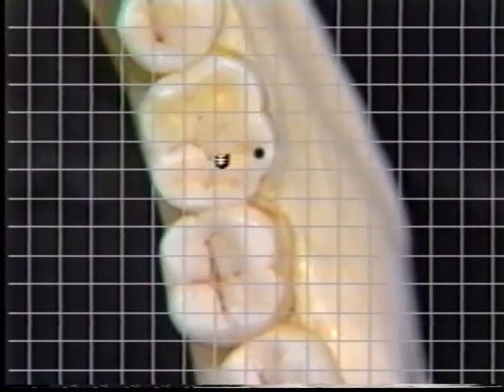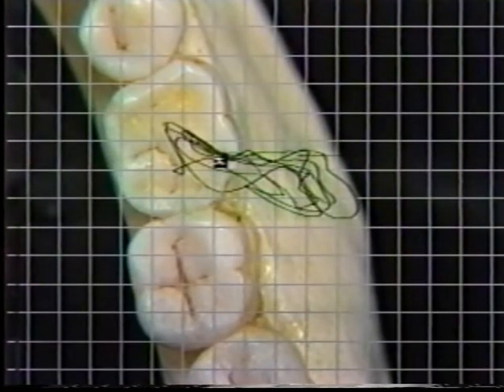As we watch the lower right molar chewing patterns, the horizontal sliding of the teeth through the intercuspal position is evident in this patient with worn teeth. The opening movement adds another dimension to this view. The computer plots also demonstrate the excessive horizontal movement pattern.